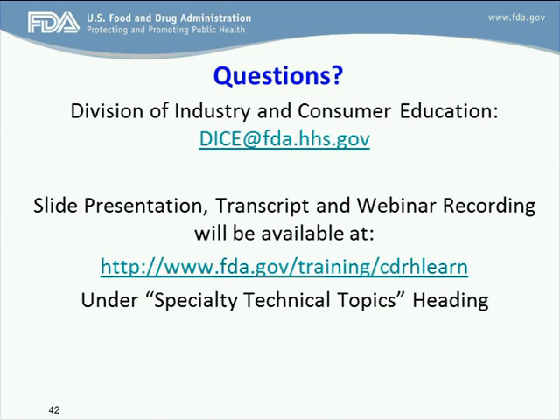I think that's more specific to the device, so you should talk to the device-specific office. But in general, if a cover is used, it's considered to reduce the soiling and make it easier to clean. So if the device is supposed to be sterilized, it should still be sterilized. There are a few exceptions to that, but those are specific devices with specific performance testing and so forth. So it would be best to talk to the device-specific office on that. Okay, great. Thank you.